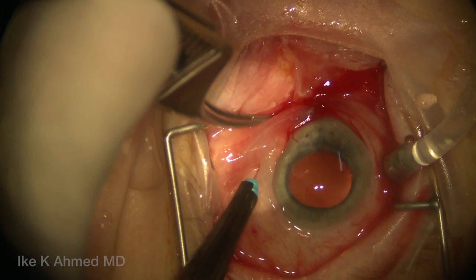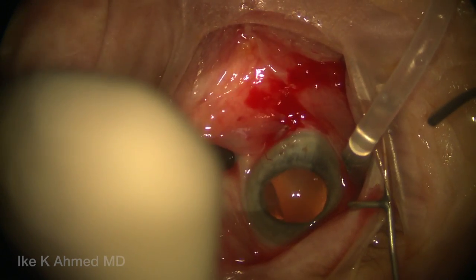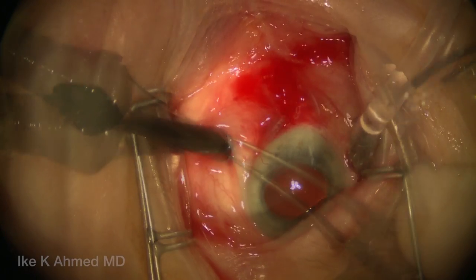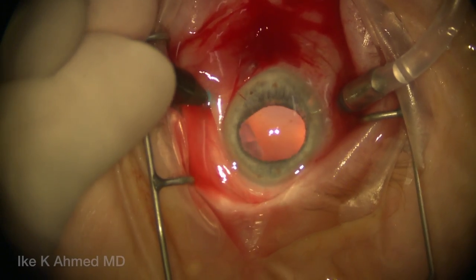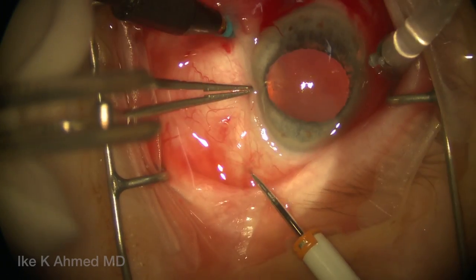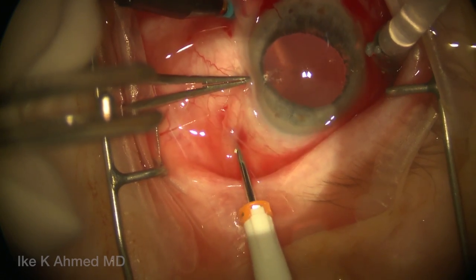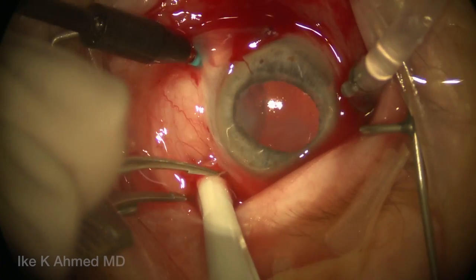Notice the tangential approach to the conjunctiva, then through the sclera tangentially, and then pointing directly perpendicular into the vitreous cavity. We're going to use a chandelier light system here, which will free up our hands for vitrectomy and IOL maneuverability. Then we're going to place a 23-gauge port for our primary vitrectomy, again tangentially, in the infra-temporal quadrant.